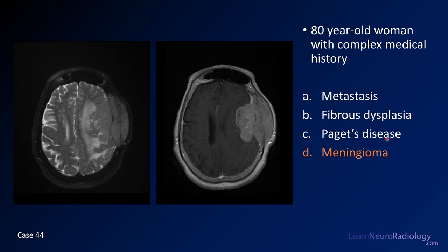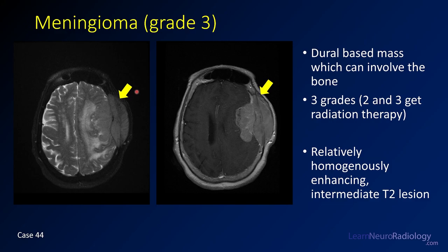This is a case of a meningioma. What you have is a mass that appears centered in the bone with a significant extradural component, a little CSF cleft around it, and a significant extracalvarial component. There is some destruction of the bone, but some of the underlying matrix remains — that's relatively uncommon for metastatic disease. When you see that, the three things in your differential should be meningioma, myeloma, and lymphoma.